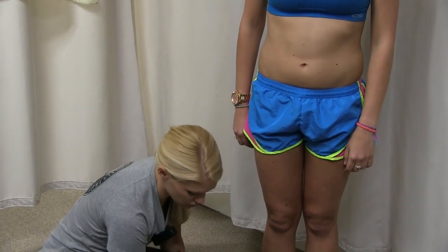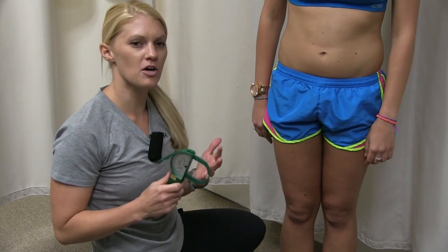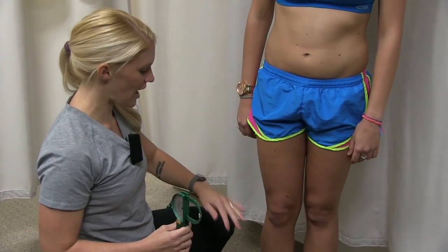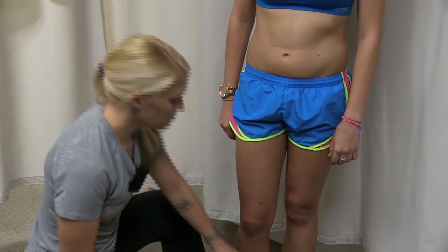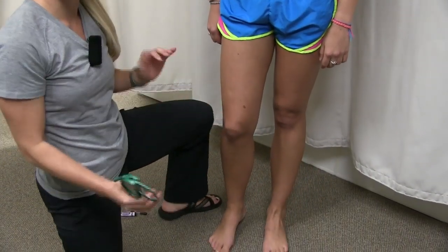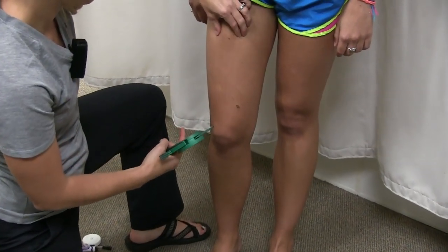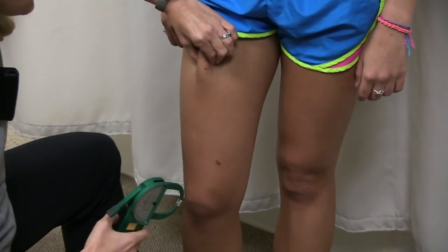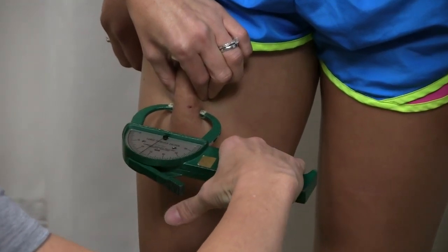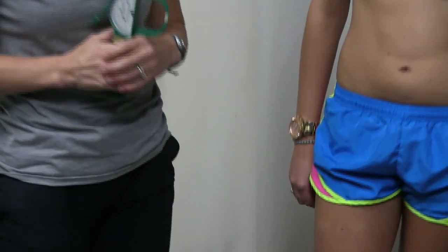The thigh is one of the trickiest measurements. Body fat varies per person, and it can be hard to pull the skin away from the thigh. Have your subject rest most of their weight on the left leg so the right leg is only slightly supported. Measure above the mark — you may need to pull a little more and actually pinch to get the measurement. On females, this is typically one of the higher numbers for body composition.